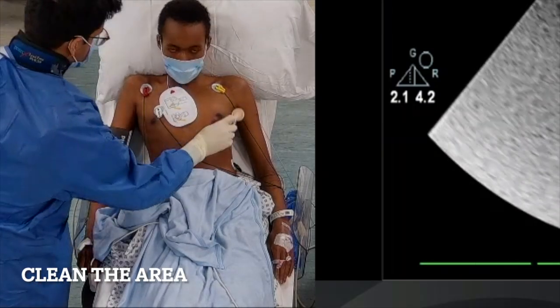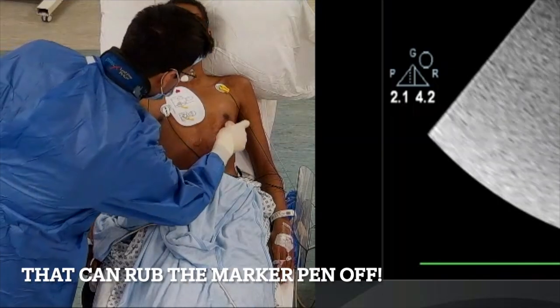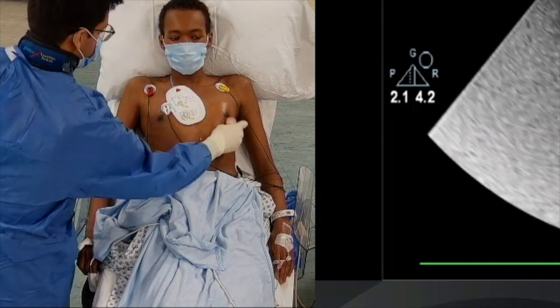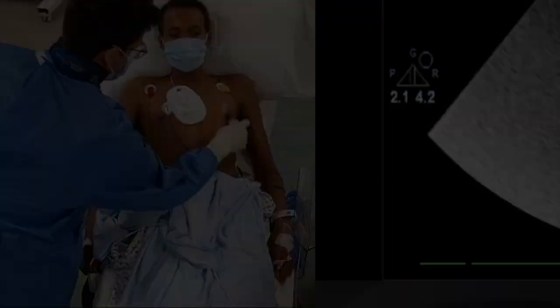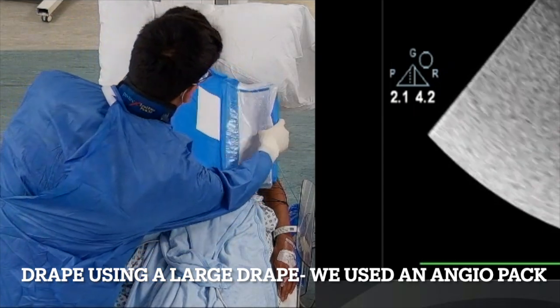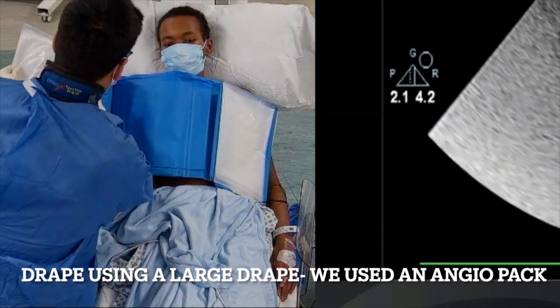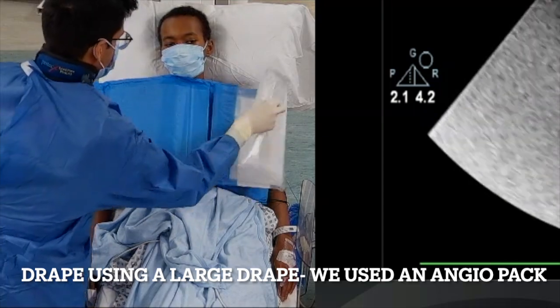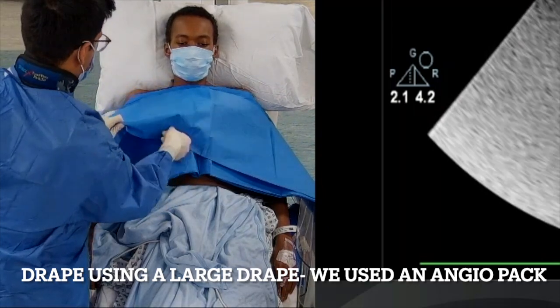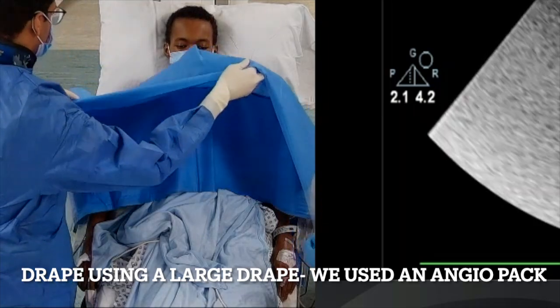We're going to clean up the whole area — warn the patient it might be a bit cold. When you clean the area, the marker can rub off, but that's fine because we still have that skin indent to guide us. We then apply a large femoral drape, being careful not to cover the patient's head and cause claustrophobia, positioning one of the holes over the apical area.